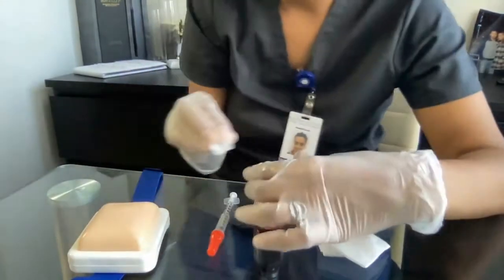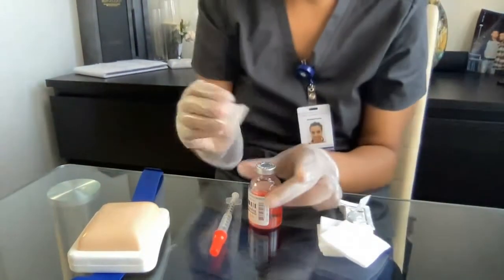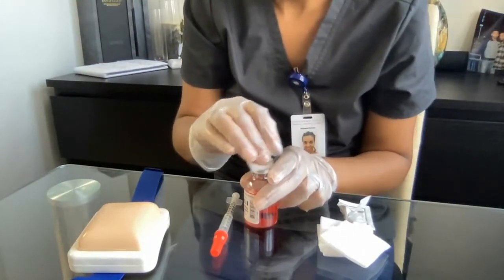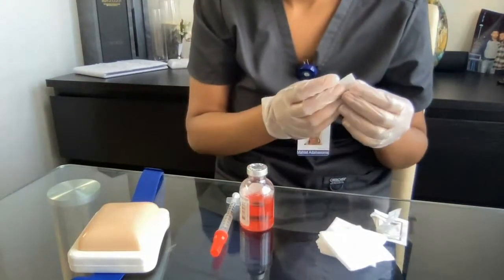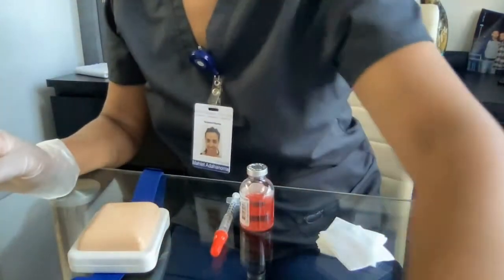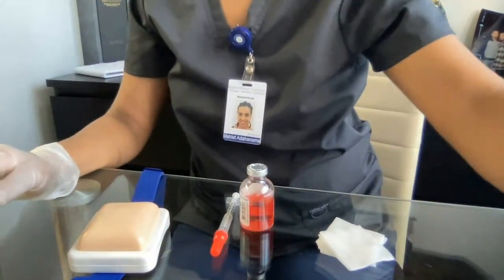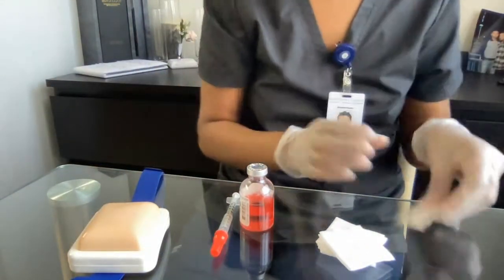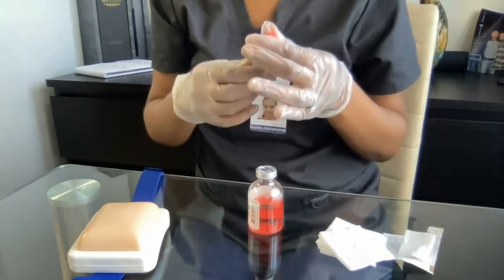I'm going to clean the vial with the alcohol swab, then take out my needle and syringe to prepare for drawing up the medication.